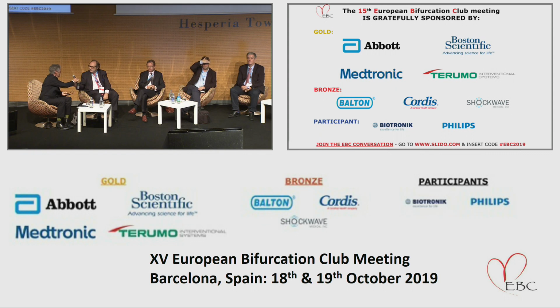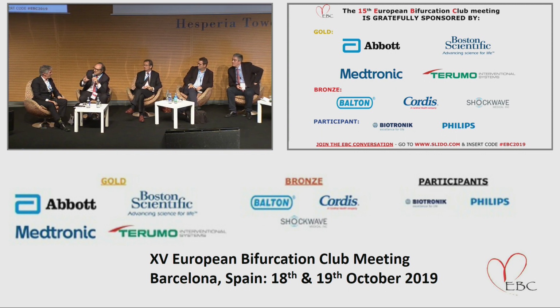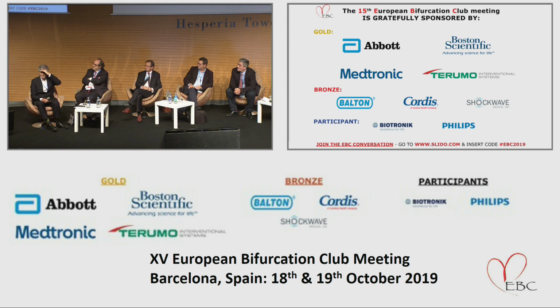Yes, Dr. Pan. My question is, if you need a second stent in left main, you put a Megatron covering the bifurcation, and you need a second stent, would you implant a second Megatron or a regular Synergy? Because you don't need this property for scaffolding. I think we're done with the big deal, which is the left main. The side branch, probably any DES can work there. So do we have any comment from the room, people who were able to compare the two?